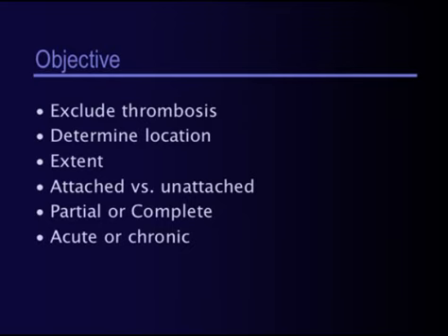So the objective of the examination is, first of all, to exclude thrombosis. And as I mentioned earlier, we want to determine the location, whether it is attached or unattached, partial or complete, and based on its appearance, whether it is acute or chronic.